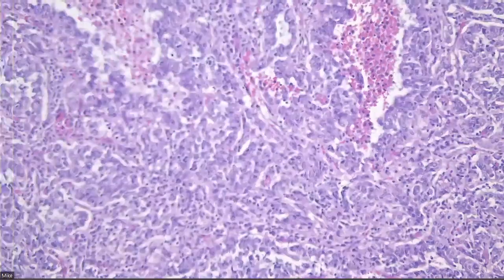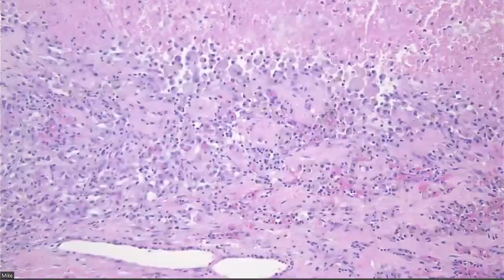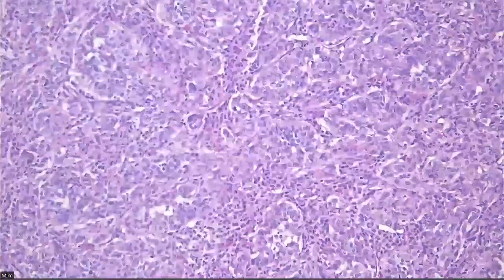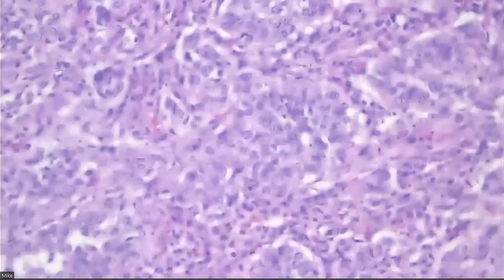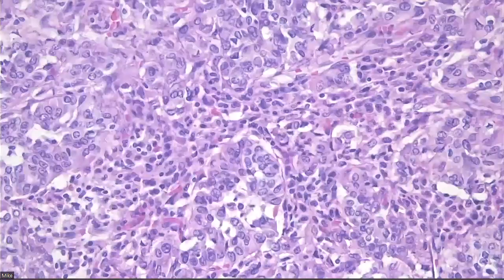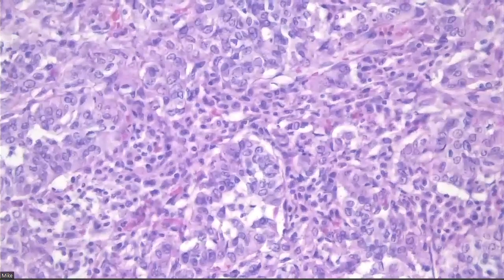So this in the past was just, okay, PTC, you know, next case with necrosis. But now we actually have a place to put this that isn't just PTC with necrosis. It's actually PTC with necrosis equals high-grade PTC. And they want to see, look, there's still even inclusions. There's two right in the, see them? They're like twins looking at us. So this hasn't lost nuclear features of PTC. Technically it doesn't meet Turin, but it's solid and it's got necrosis and it's nasty, so it's high grade.